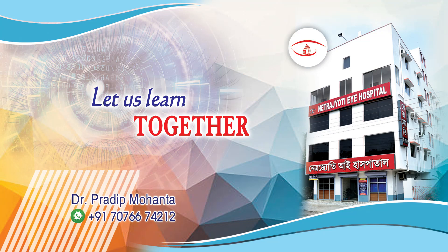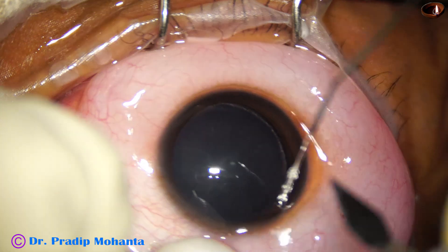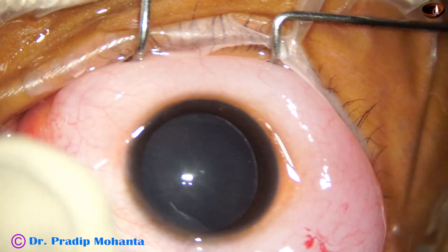Welcome to my work base at Ranakh Heart, West Bengal, India. This is a cataract in a seven-year-old child having diabetes. Let us see the surgery.